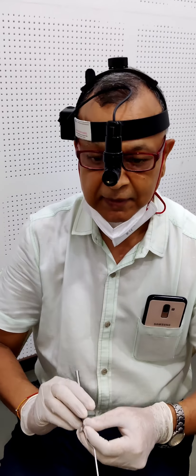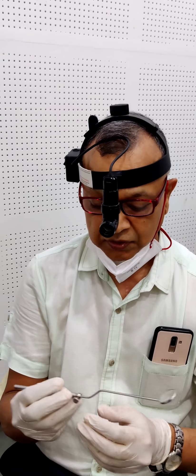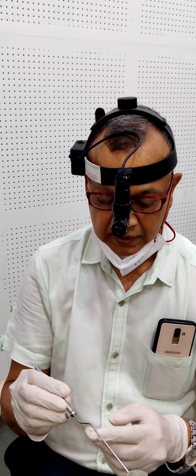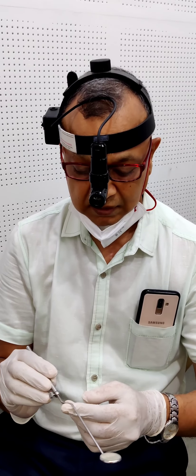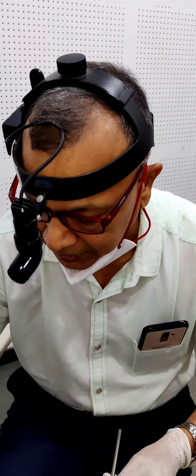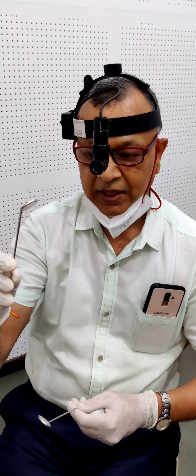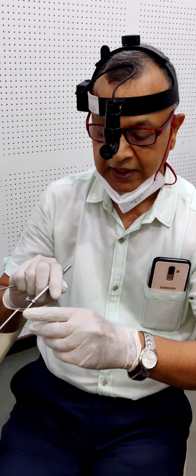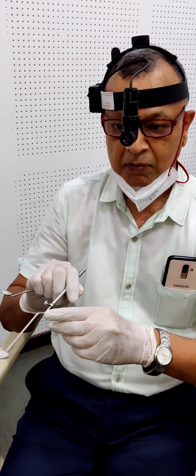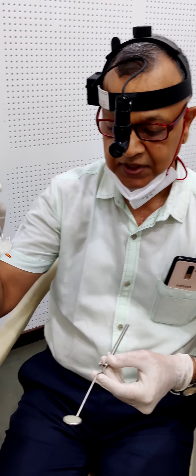Posterior rhinoscopy examination will be performed with the help of this posterior rhinoscopy mirror. You can see this curve — that is the characteristic feature of this rhinoscopy mirror. In the laryngeal mirror, there will not be any curve; it is a straight mirror only. In this shaft, there is no curve. The bayonet shaft is the characteristic feature of the posterior rhinoscopy mirror, whereas the laryngeal mirror shaft is straight.